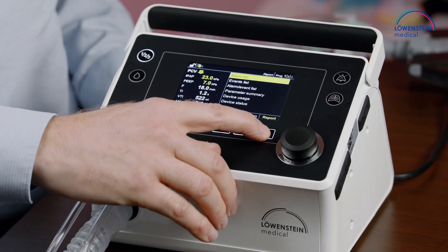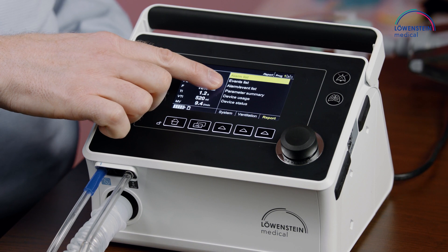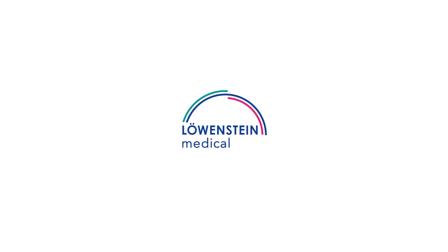In the manual report, we have an alarm list, an event list, a combined alarm and event list, and a parameter summary.